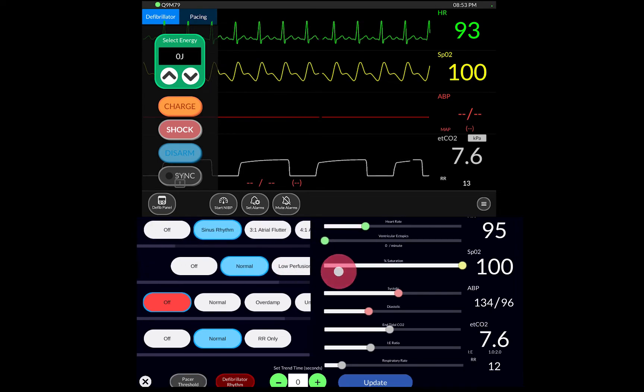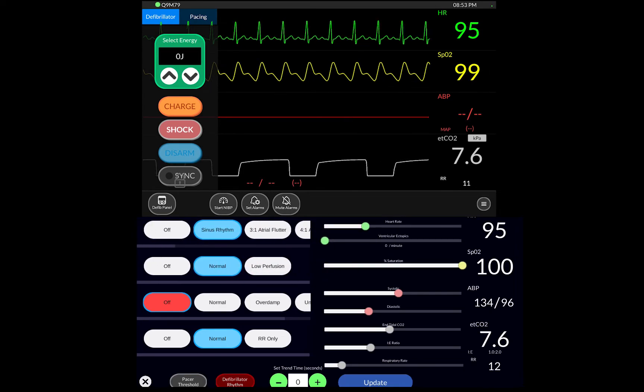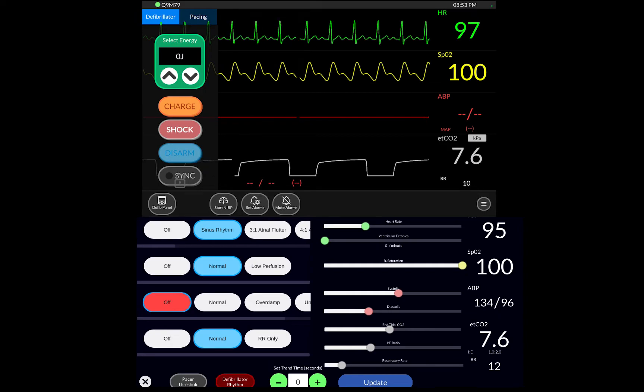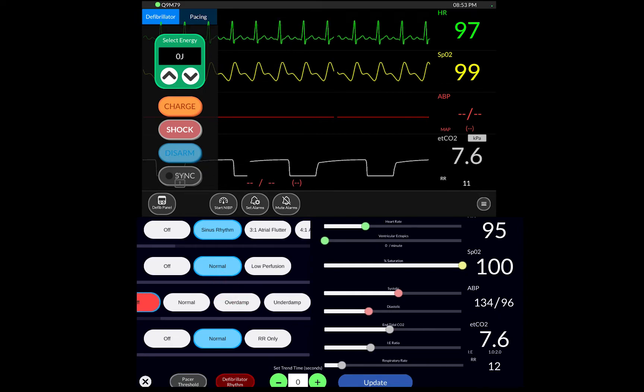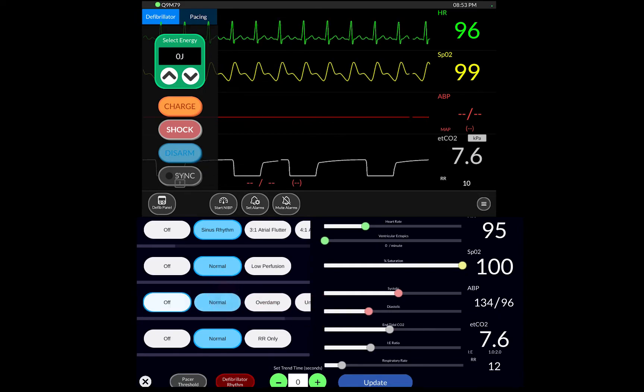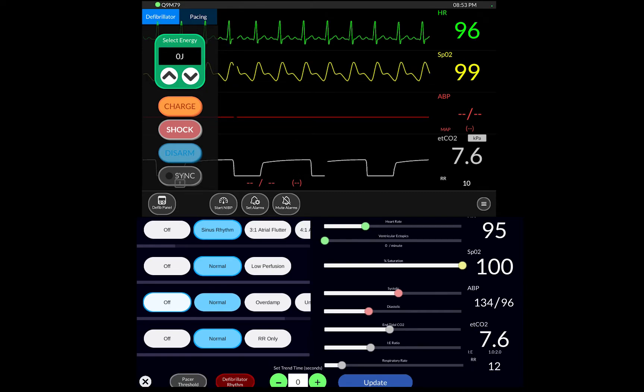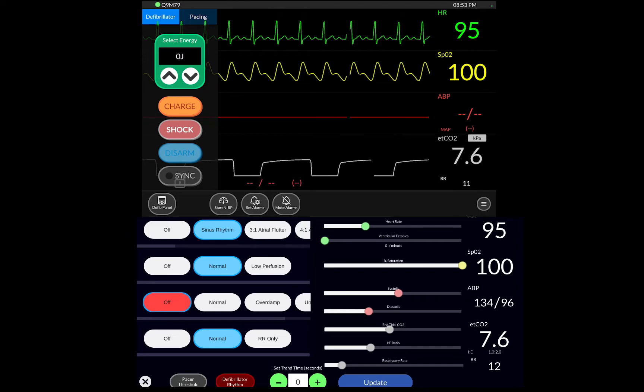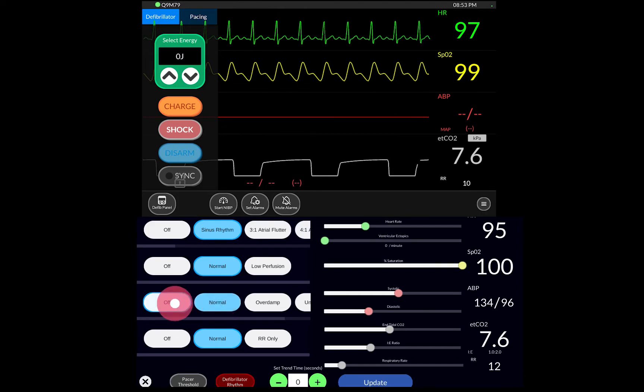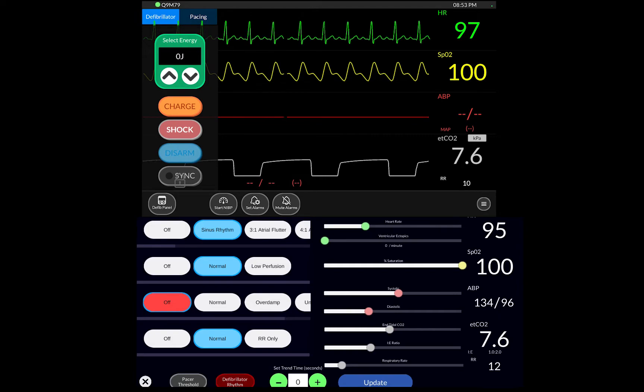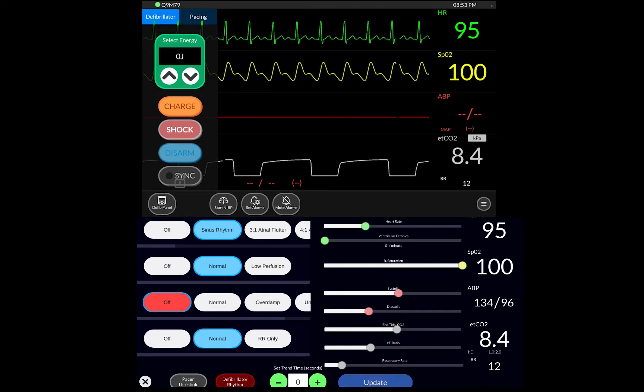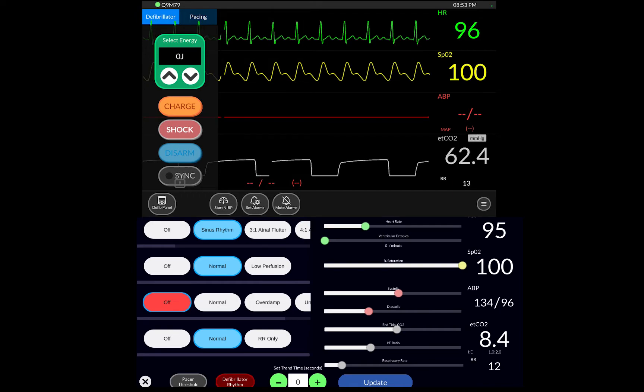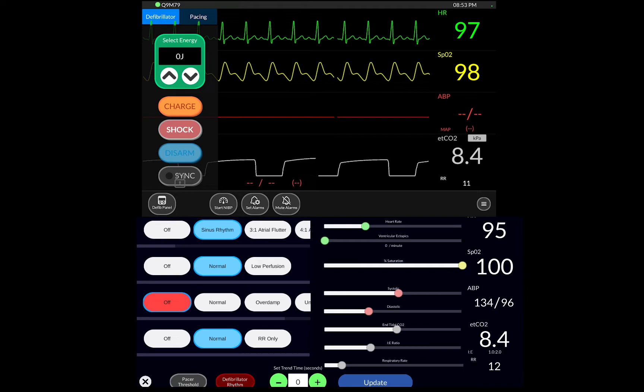Then there's the saturation. Then there's the arterial BP or if you have an A-line, but if you hit normal on this and update it's going to give you an A-line on the monitor and you probably don't have an A-line on the patient. You can't then remove it. So don't click on that normal and update. In terms of the ETCO2 you can just control it like this. It's important to see on the monitor that it starts on KPA, not millimeters of mercury.